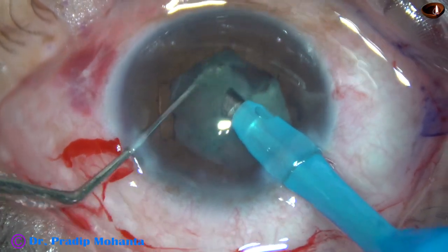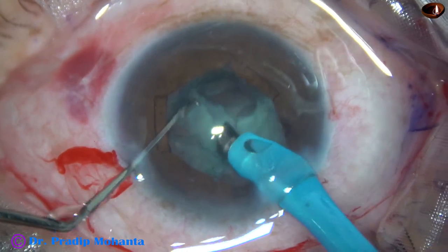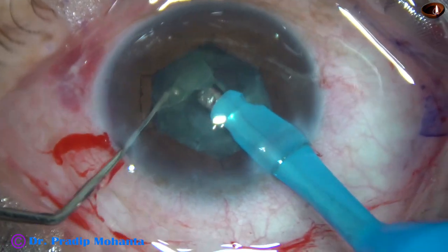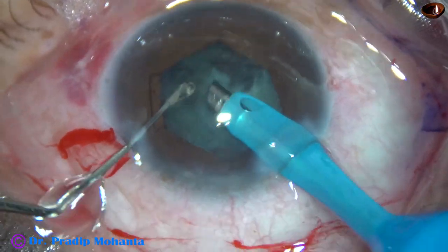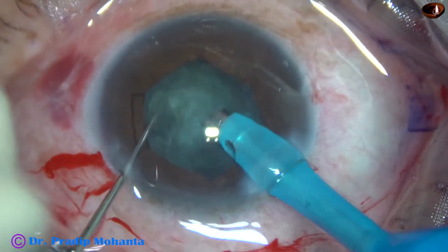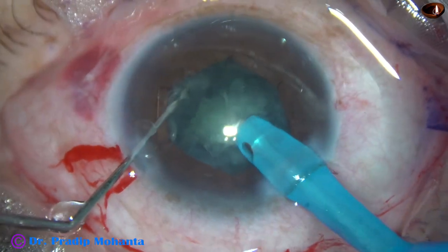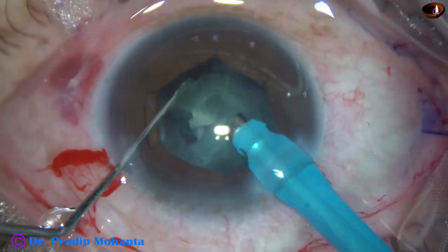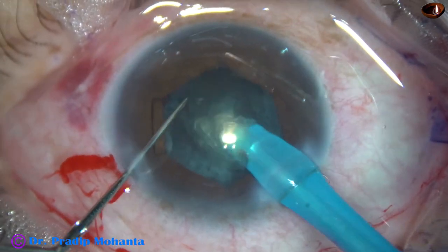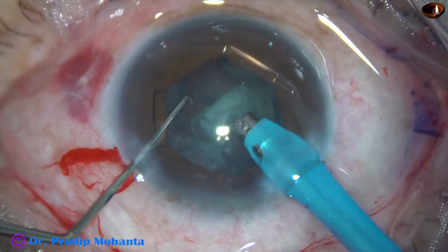This is a free nuclear fragment and this is a part of the nucleus — could not hold it, it got emulsified. So I rotate the nucleus to the other side, get onto this thick portion, it becomes free, and I could emulsify this. And now this is the last part of the nucleus.